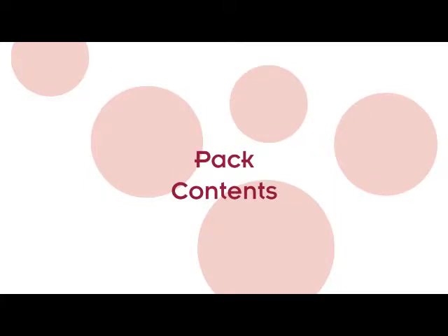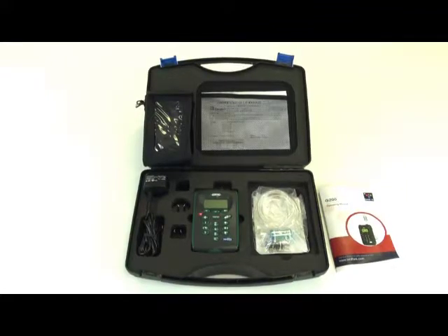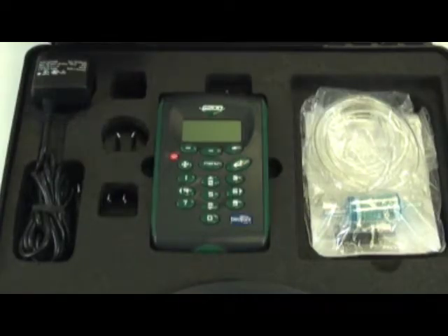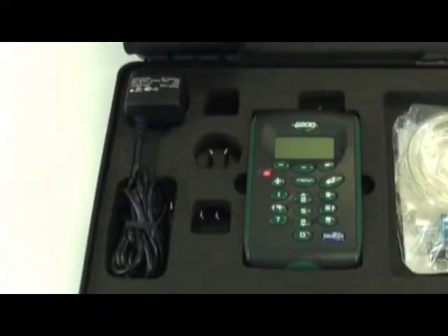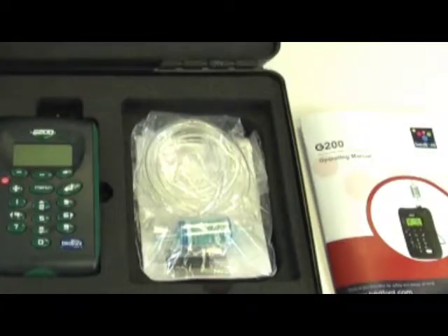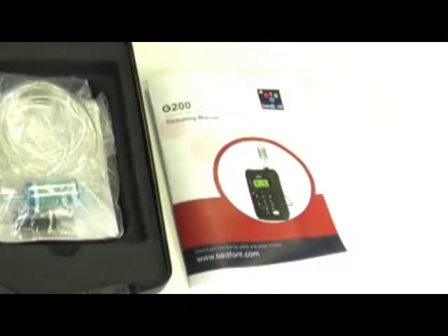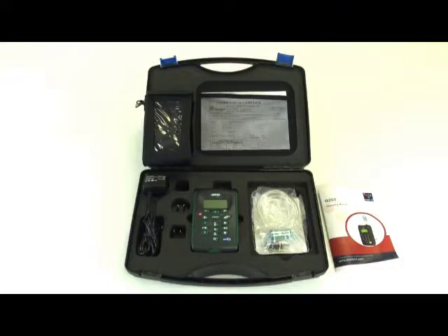Pack contents. When you receive your G200 you should find the following: one G200 analyser, a UK charging plug, three universal adapters, one moisture filter, one section of tubing, a hard surrounding carry case, a factory calibration certificate, a G200 manual, and three CO2 lime filters.